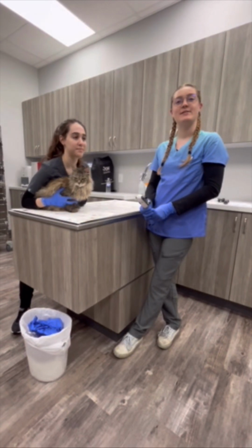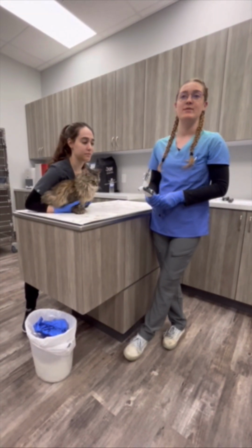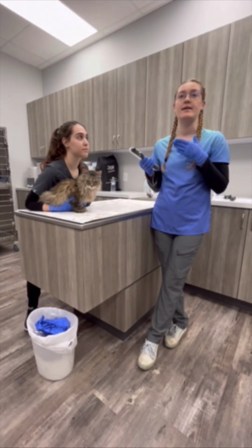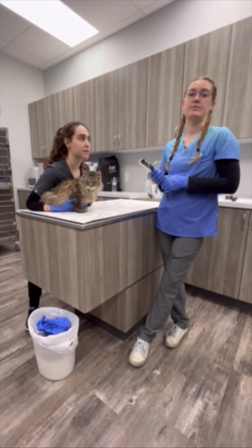I am now performing a tonometry test to check the eye pressure of Pup. Restraining the patient and applying too much pressure around the eye or under their chin and neck region can also cause false readings and indicate increased pressure.